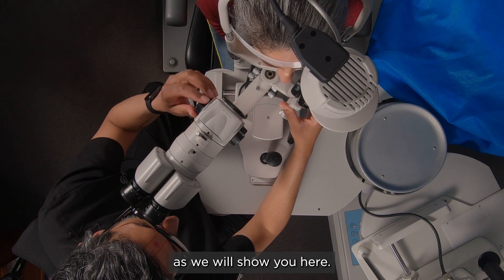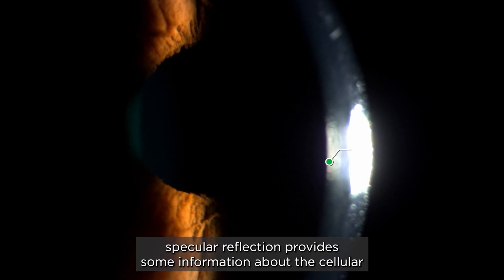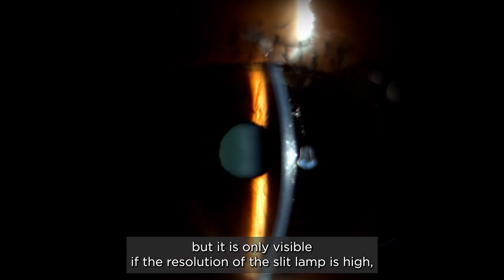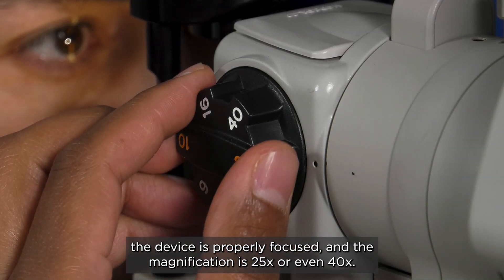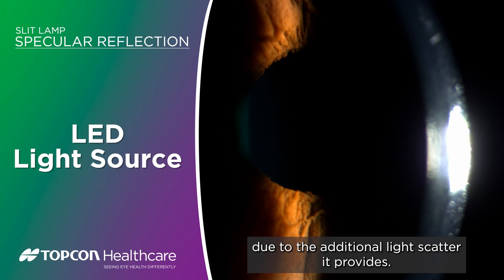I will concentrate on viewing the Purkinje image relating to the back surface of the cornea, the corneal endothelium. Unlike any other slit lamp technique, specular reflection provides some information about the cellular structures of a small area of the corneal endothelium, but it is only visible if the resolution of the slit lamp is high, the device is properly focused, and the magnification is 25 times or even 40 times. An LED light source also enhances the view due to the additional light scatter it provides.